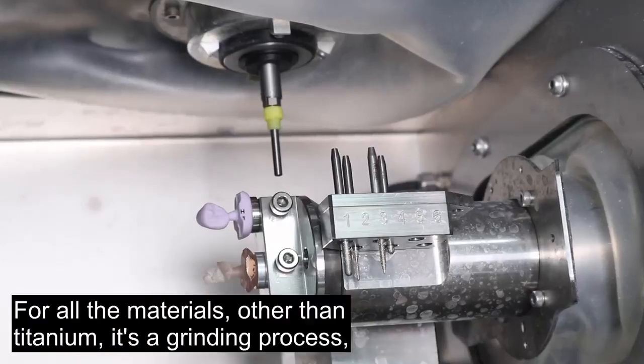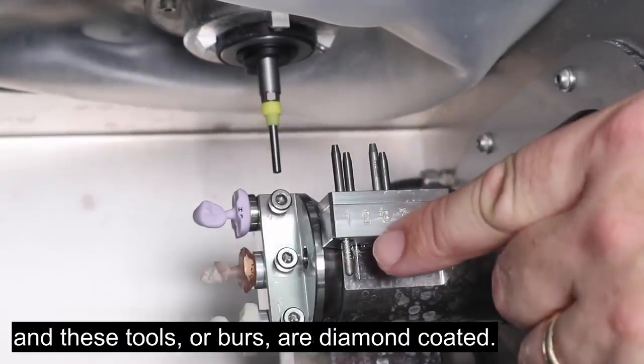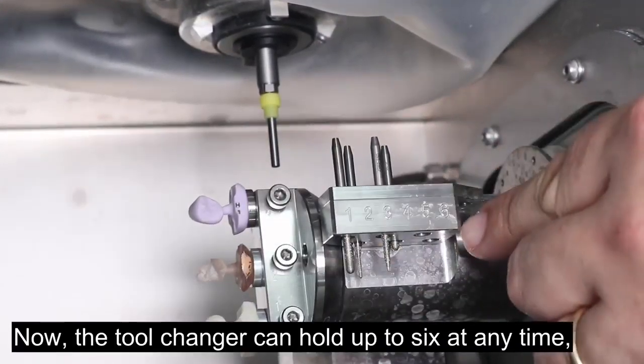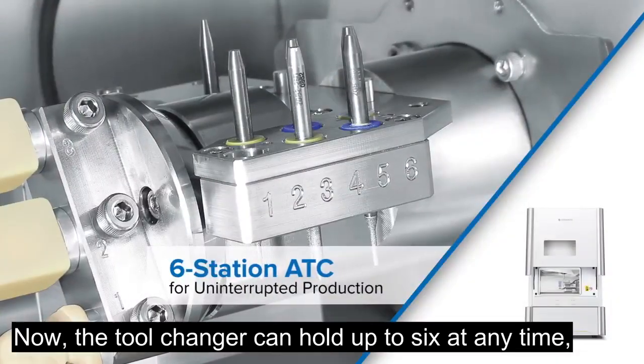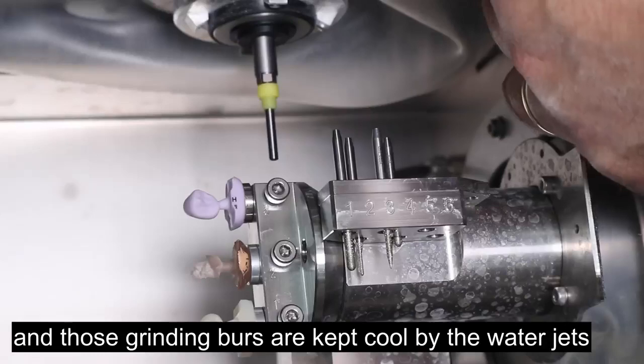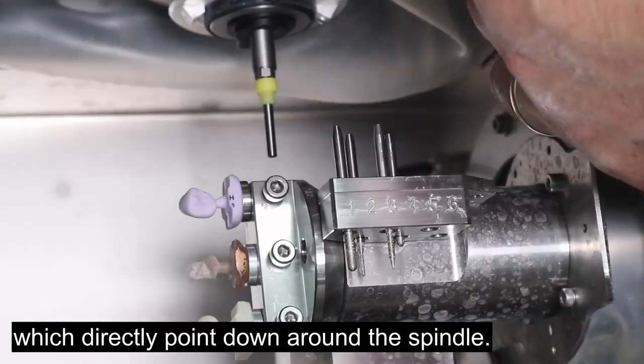For all materials other than titanium, it's a grinding process and these tools or burrs are diamond coated. The tool changer can hold up to six at any one time, and these grinding burrs are kept cool by the water jets which directionally point down around the spindle.